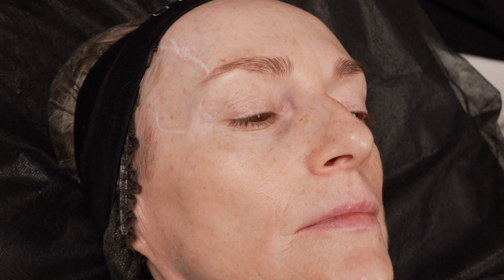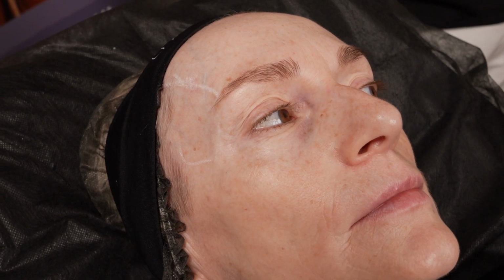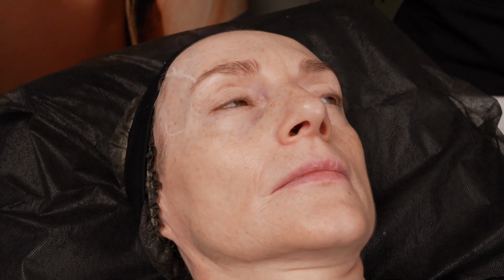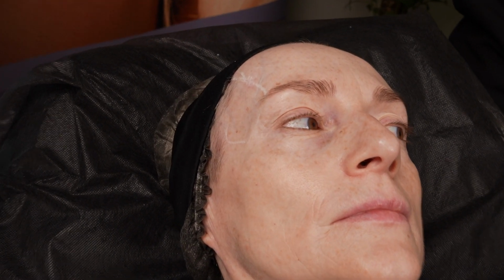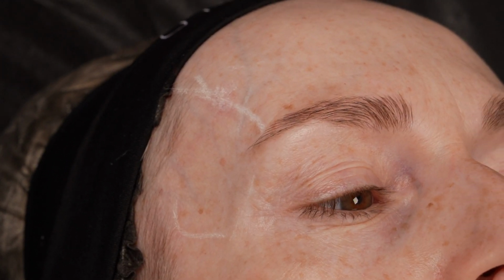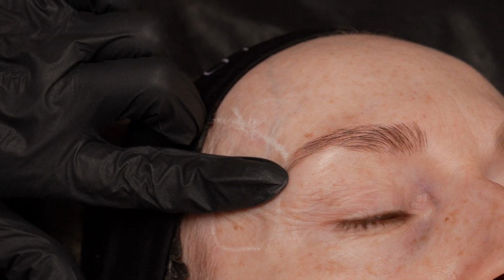It could be filler grade 4 or 3. I would take 2. What would you recommend to use? Not 4, 3. I would choose 2. Be mindful. Because it will be really easy to resolve, because she's too thin. Let's do 2. Thin skin, yes.